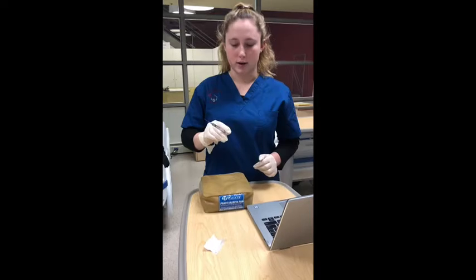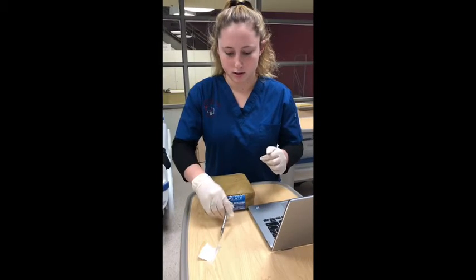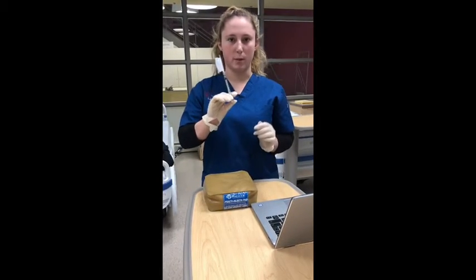And then what I'm gonna do is I'm going to recap the needle for safety. And then I can dispose of it in the sharps bin. For my documentation, I would keep the 8 rights of medication in mind, and I would make sure to document that I gave Mr. Mancini a subcutaneous and intramuscular injection in a timely manner.